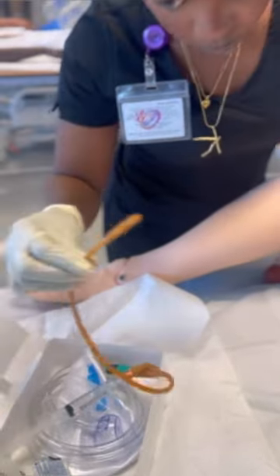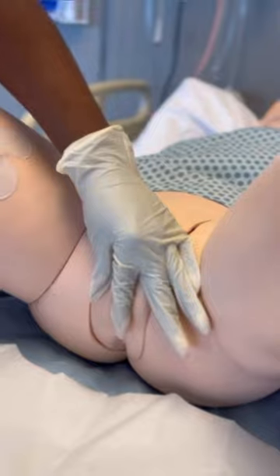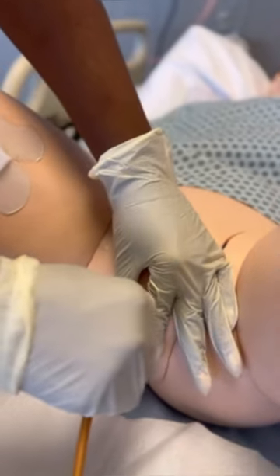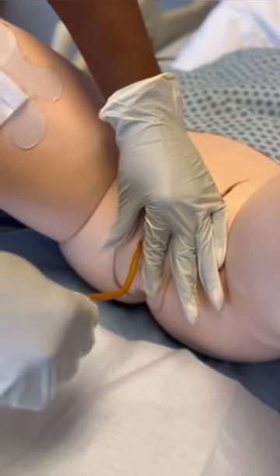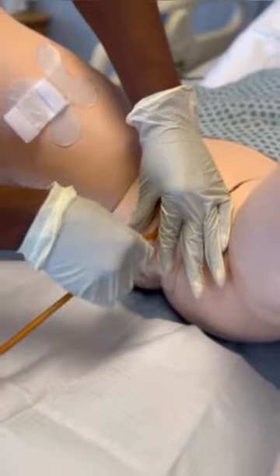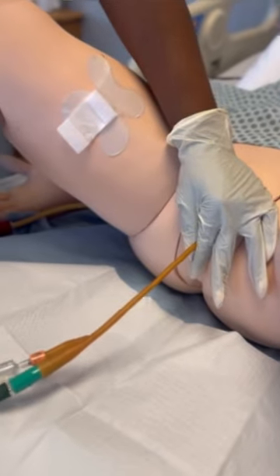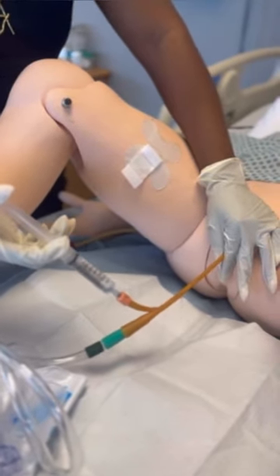Now that your patient is clean, take your lubricated catheter, open up the patient, ensuring that you are going through the urethra, which is at the top. Ask your patient to bear down and go in. Make sure that when you're inserting the catheter, you are not touching the patient with your sterile hand that's holding the catheter. Once you see a flashback of urine, advance the catheter one to two inches further and secure it with your dirty hand.